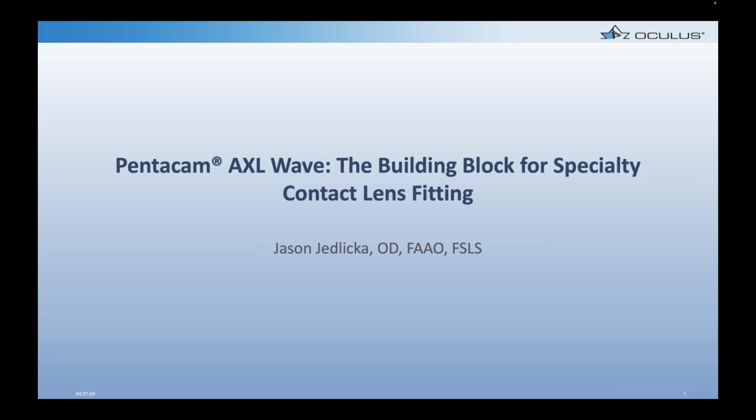As most people know, Dr. Jason Jedlicka is an associate professor at Indiana University School of Optometry and the chief of cornea and contact lens service. He's a past president of the Scleral Lens Education Society, a diplomate in the cornea and contact lens section of the American Academy of Optometry, and a fellow and past board member of the Contact Lens Society of America. He has special interest in studying ocular surface shape and contact lens design and is a partner in the Lens Design Solutions, a contact lens design development team. With no further ado, Jason, take it away.